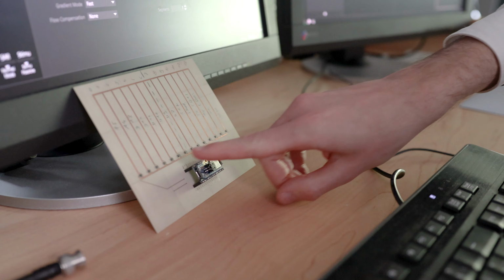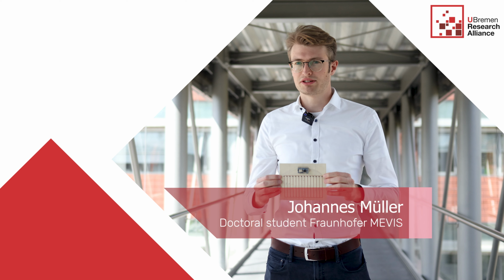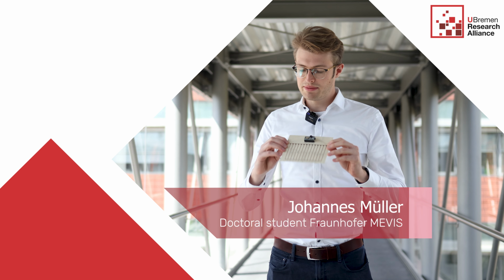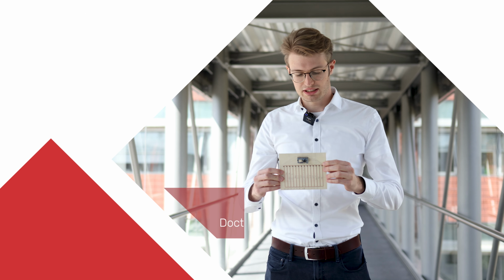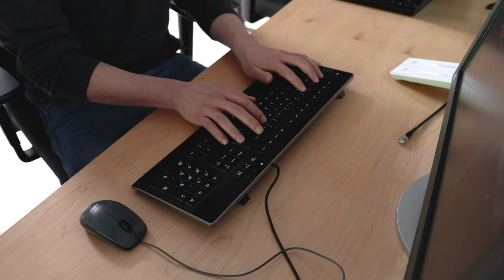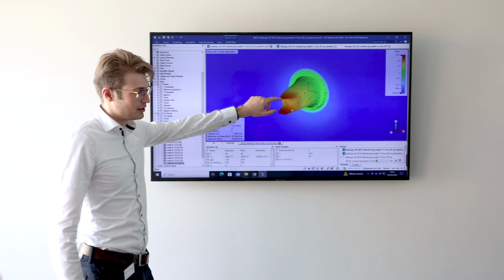The metasurfaces we are using enable us to change the behavior in the MR scanner. As you can maybe see here, we have adjustable components on those metasurfaces. We don't know beforehand what kind of magnetic field distribution we actually get when we set the parameters in some way. AI is enabling us to find out the correct parameter configuration in order to achieve a higher imaging efficiency.